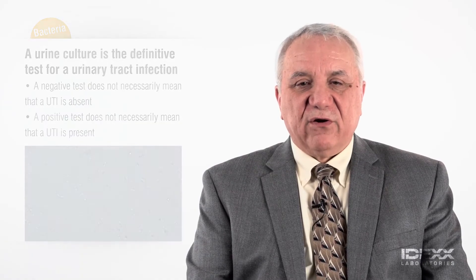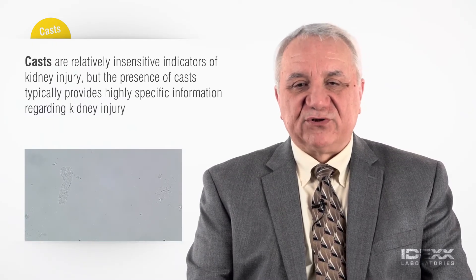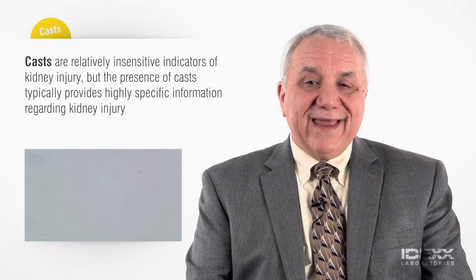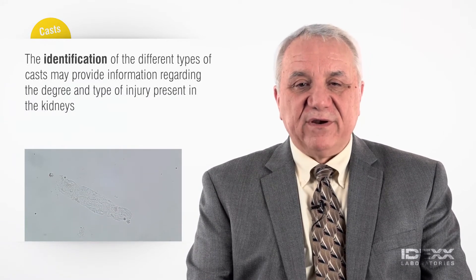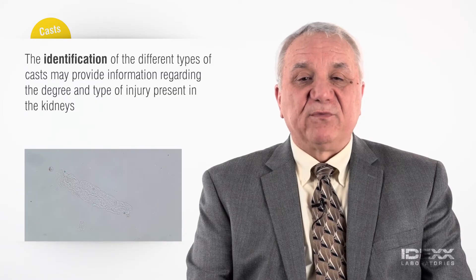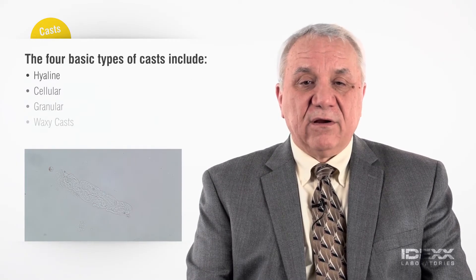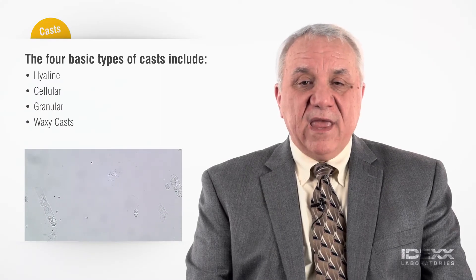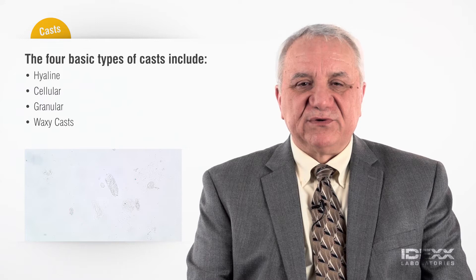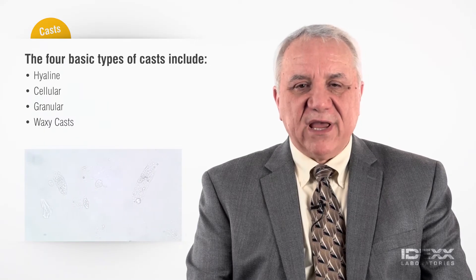A second category of formed elements of a urine specimen is the cast. Casts are cylinders of material that have been collected within the distal nephron tubular structures of the kidney. They are relatively insensitive indicators of kidney injury; however, when identified, the presence of casts provides highly specific information regarding kidney injury. In many cases, the identification of the different types of casts provides information regarding the degree and type of injury present in the kidneys. The four basic types of casts include hyaline, cellular, granular, and waxy casts. With practice, characterizing the casts as broad or narrow is possible, and this additional information may be helpful in characterizing the presence of significant renal compromise and compensation.